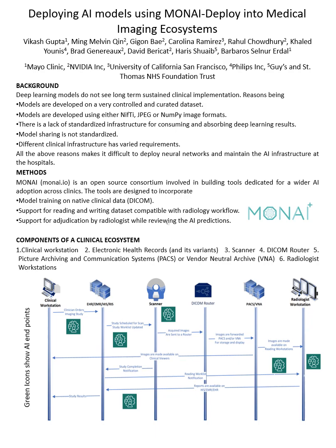In MONAI, we have standardized all the imaging protocols and given open source tools which can be modified by the user to design their own tools. Such open source framework also allows us to standardize the model sharing and reusing of components of the deployment infrastructure. The current MONAI framework allows for model training and inference using the DICOM imaging format on raw medical data. It also provides us tools to wrap the results of DICOM compatible formats like DICOM structured report and DICOM seg.